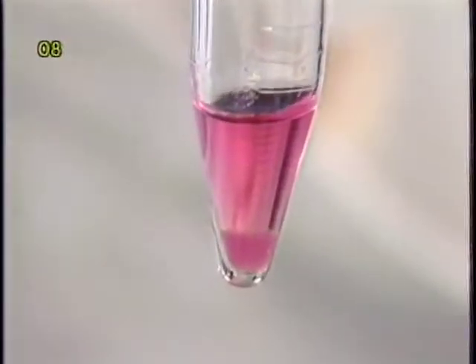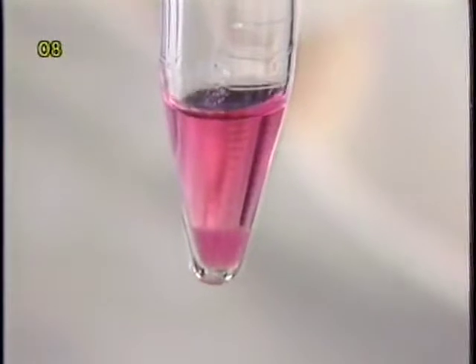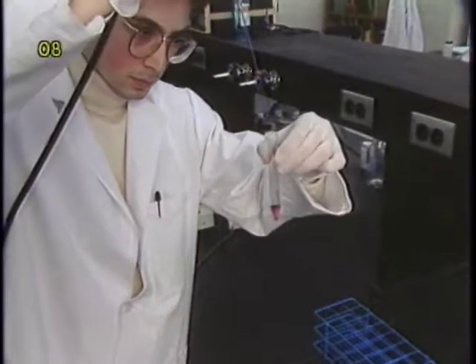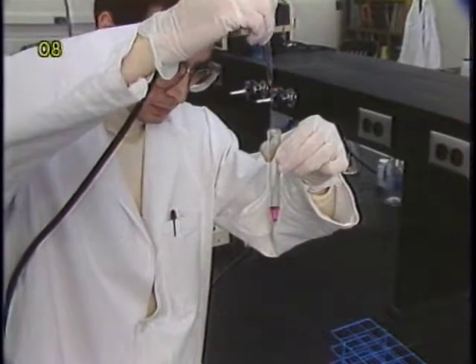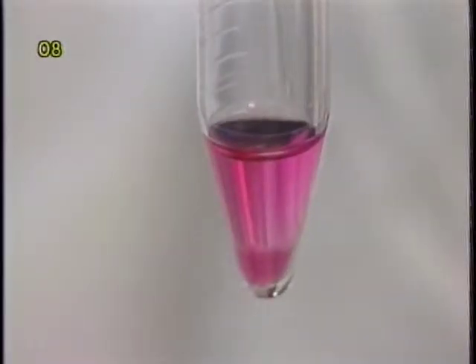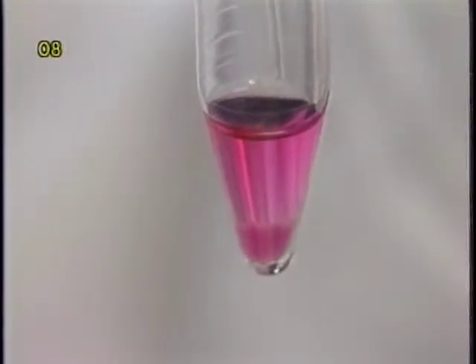After centrifugation, a sharp boundary is seen between the surface of packed microcarriers and the supernatant. Vacuum suction is then applied to remove the supernatant. Care should be taken to avoid sucking off any microcarriers.